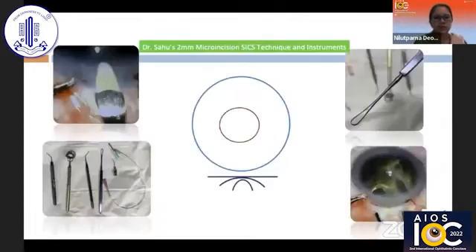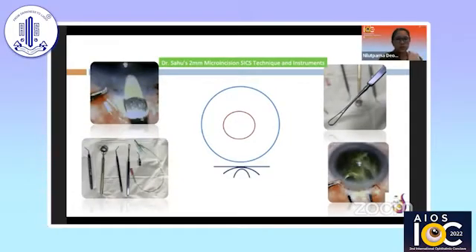Today we will be describing Dr. Sahousar's two millimeter micro-incision technique, wherein the instruments have also been modified in order to correspond to the small incision size — that is, the two millimeter.